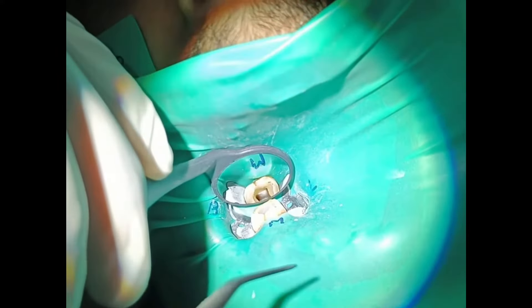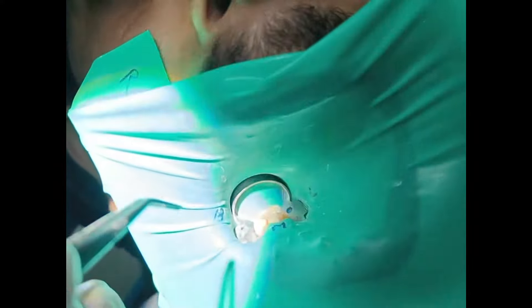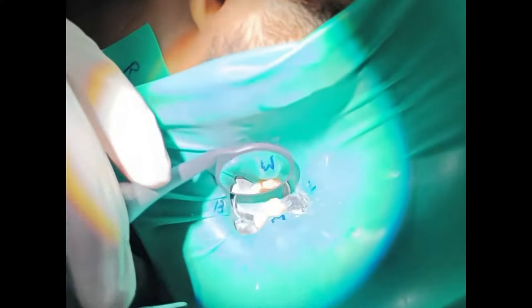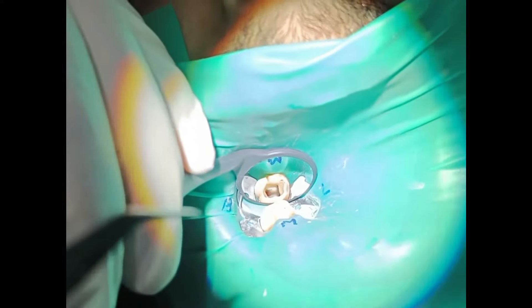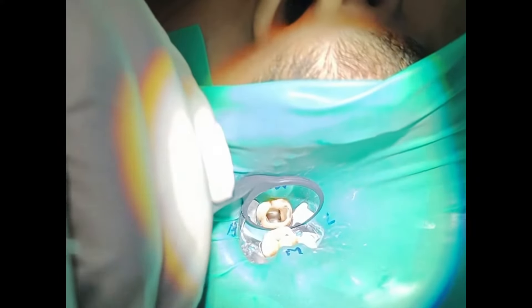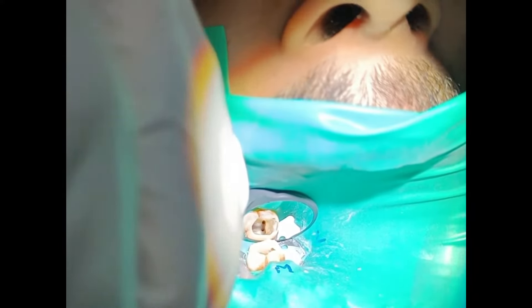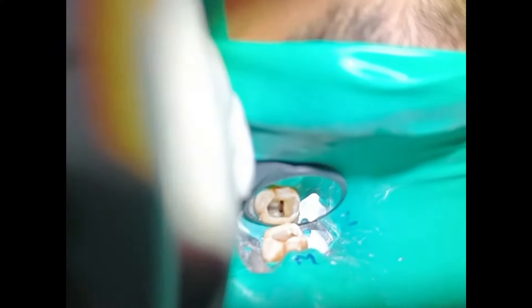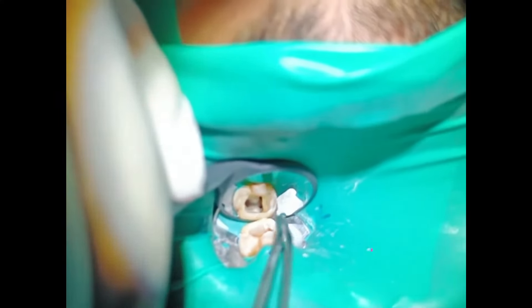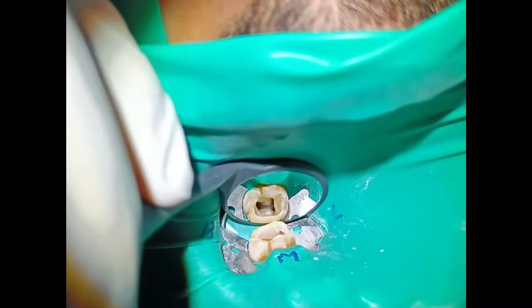So nothing to worry about — it is just a rotated tooth. A very peculiar case of a rotated tooth. You should not always follow the books; you should go with your instincts as well. My instinct said that the mesio-buccal and mesio-lingual are on the lingual side.